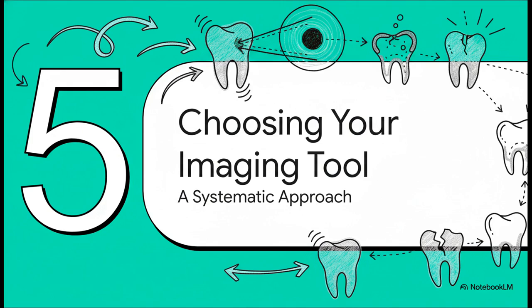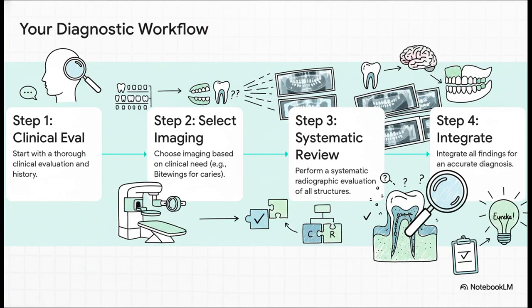Okay, we have covered a ton of ground. We've gone from everyday cavities to complex resorptions to genetic anomalies. So now, the most important part. How do we bring it all together into a practical system that you can actually use in the clinic? So if you only take one thing away from this whole talk, let it be this. You have to have a system.